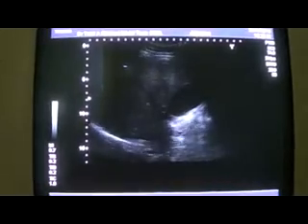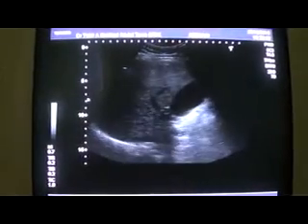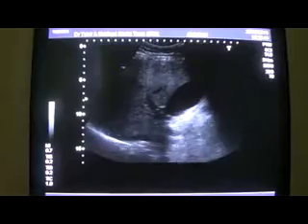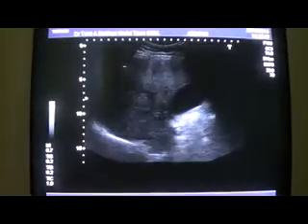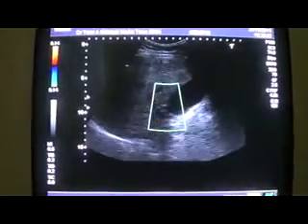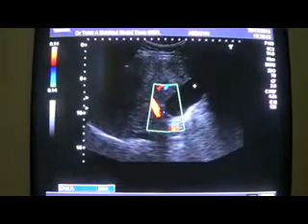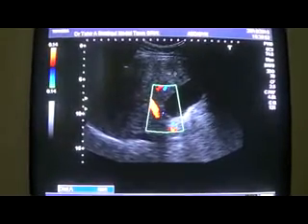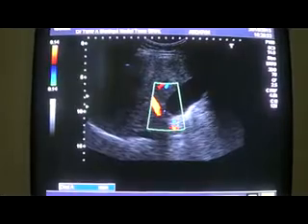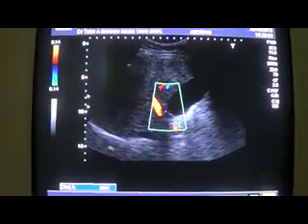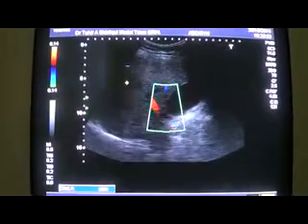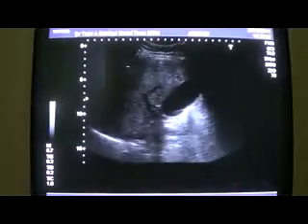This ultrasound is that of a 35-year-old male. I am showing you the gallbladder, the portal vein, the liver, and the right hemidiaphragm. The liver is fatty but otherwise there is no significant finding relating to the liver, gallbladder, vessels, or ducts.